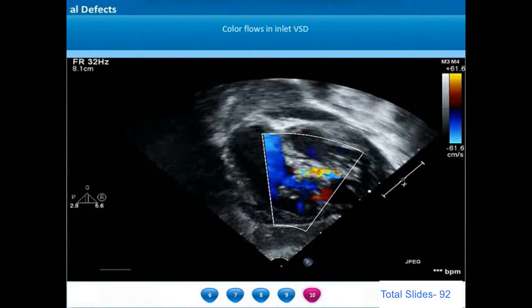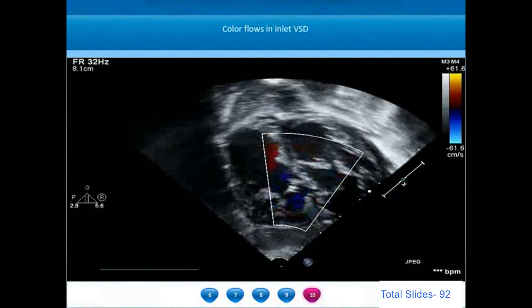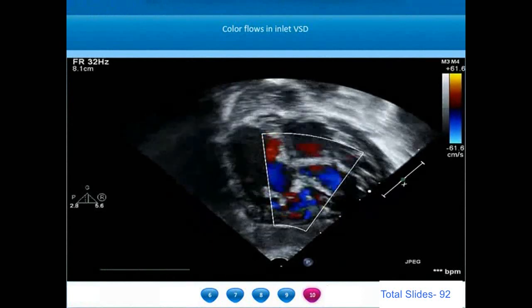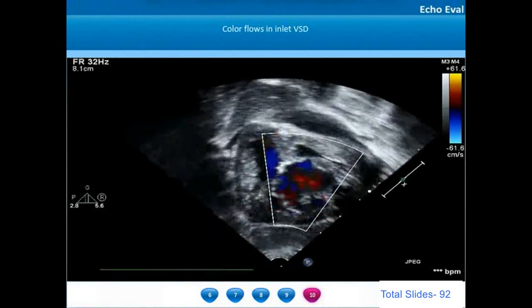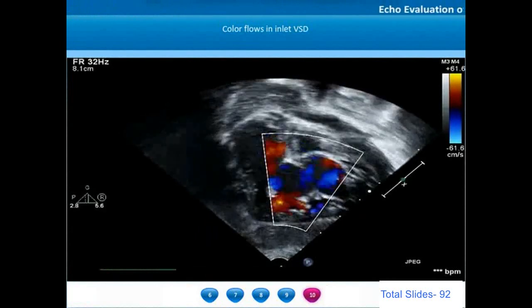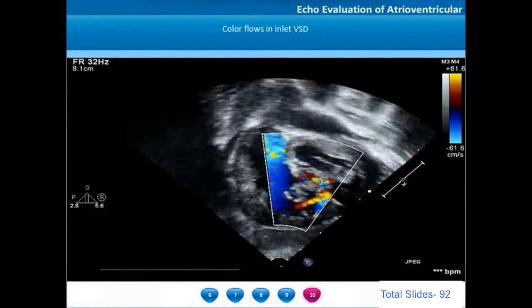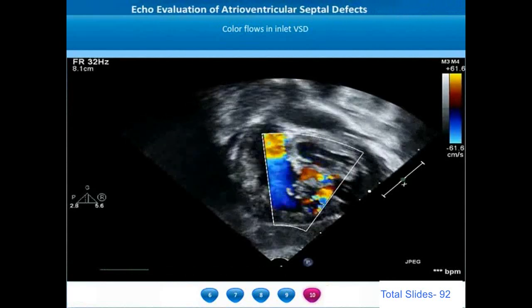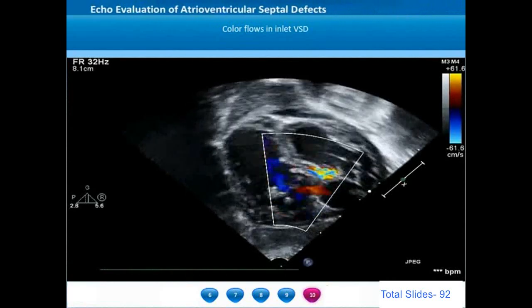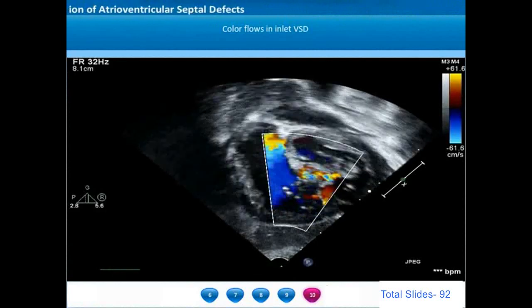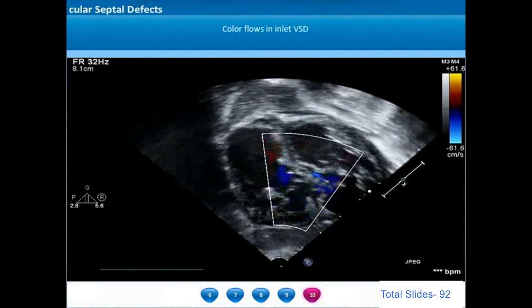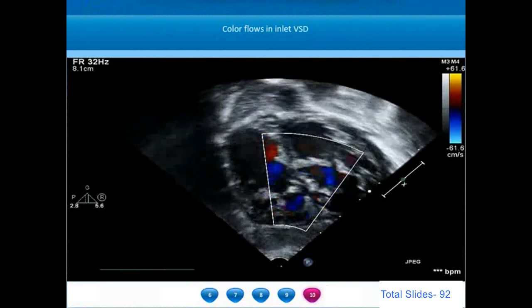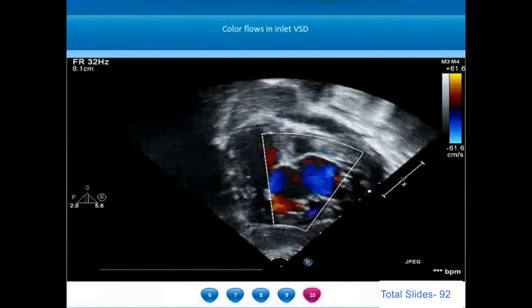On the subcostal short axis view with color Doppler, we can appreciate the flow of blood across the inlet ventricular septal defect. Beneath the inferior bridging leaflet there is a color flow from the left ventricle towards the right ventricle, indicating that the VSD is primarily located beneath the inferior bridging leaflet.